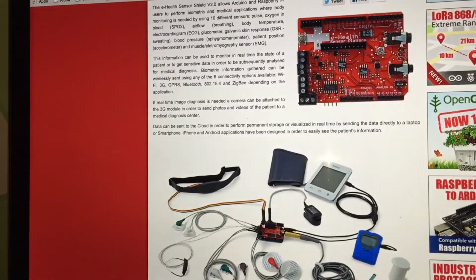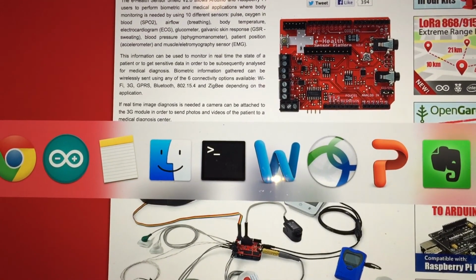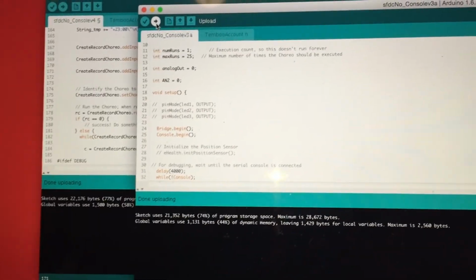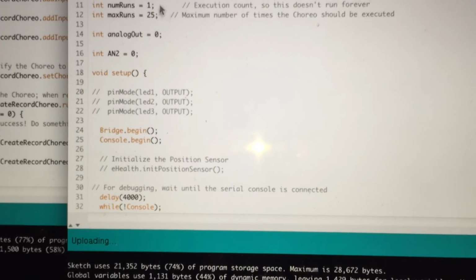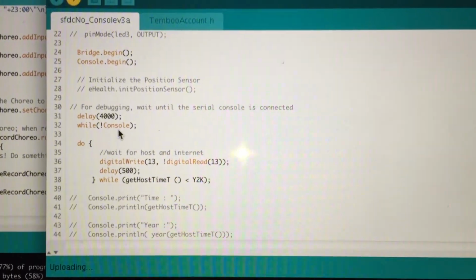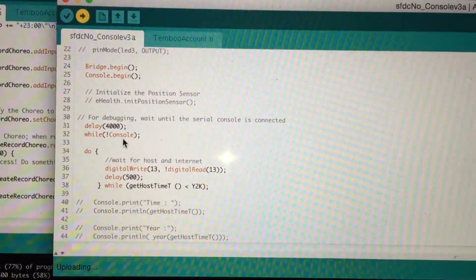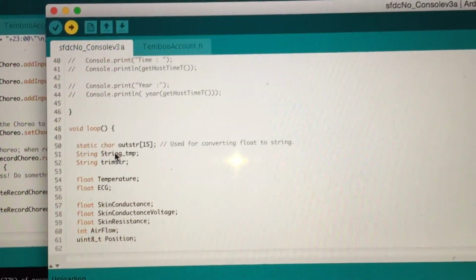Let me get on to the Arduino IDE. Okay, let's reload the code in there. The code is basically some amount of libraries that I've got from a website called Temboo. Libraries from the eHealth website for connecting and being able to display all those sensor readings.